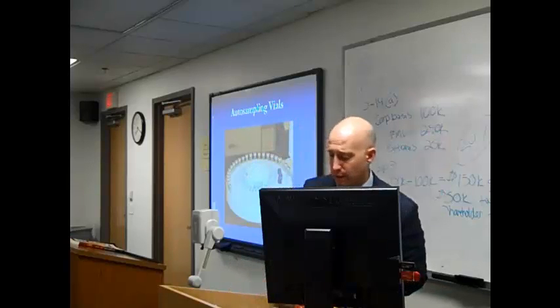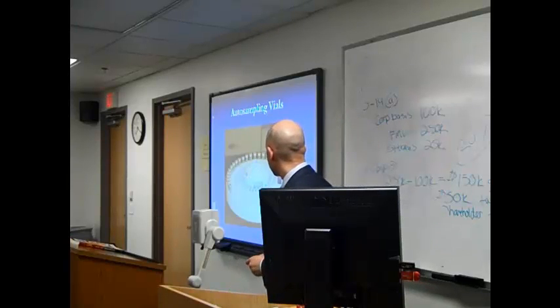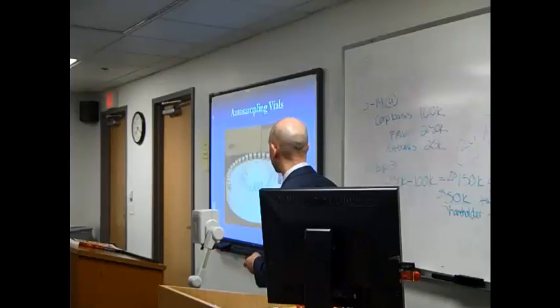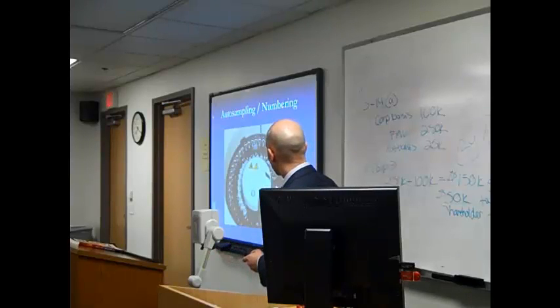So as I was saying, here are these little vials that are capped. They have a septum on top of it, and a needle goes down, takes out the headspace, the vapor, sucks it into the machine. This whole thing can be filled with hundreds of vials. As long as it's typed into the computer properly, there shouldn't be a problem. And you see how the numbers correlate to each vial.